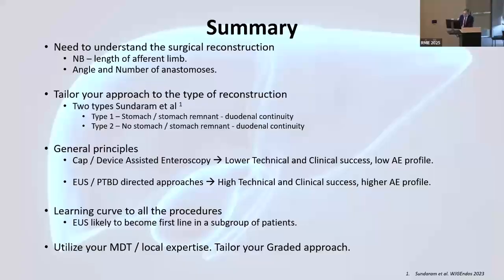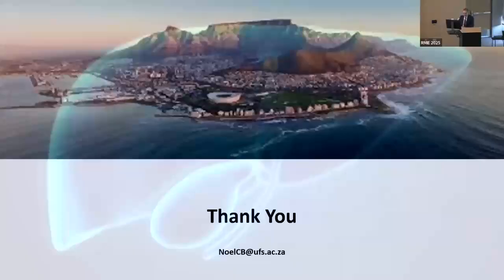If you take EUS, and I think this is going to change, we are now seeing that in high-volume centers our complication rates have dropped well below 5 to 6%. So that might change in the near future as we become more and more comfortable. And lastly, utilize your local expertise and your multidisciplinary team. In my opinion, you need to tailor your approach rather than follow a pure graded approach. And that's it. Thank you.